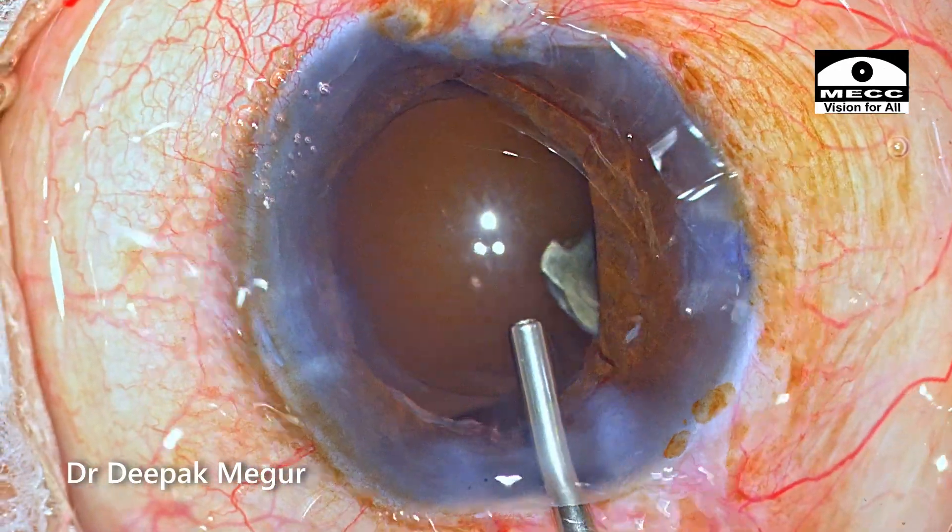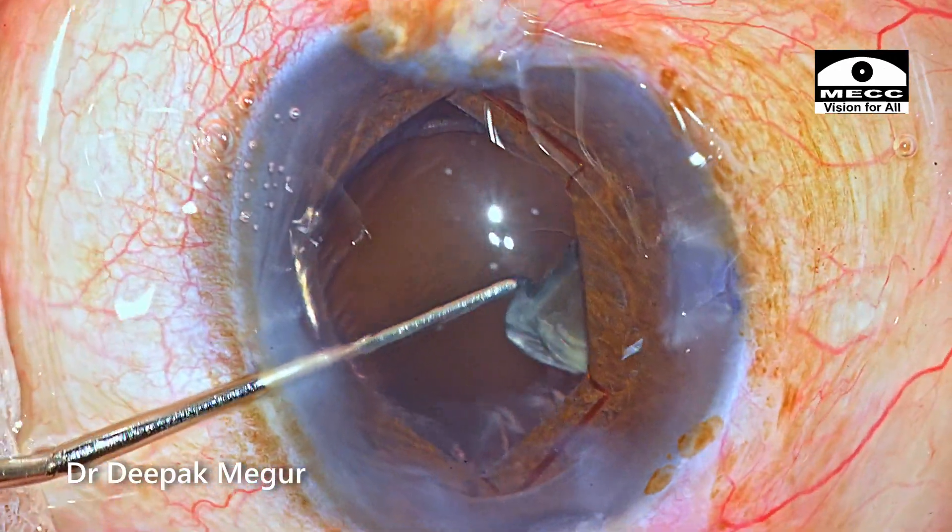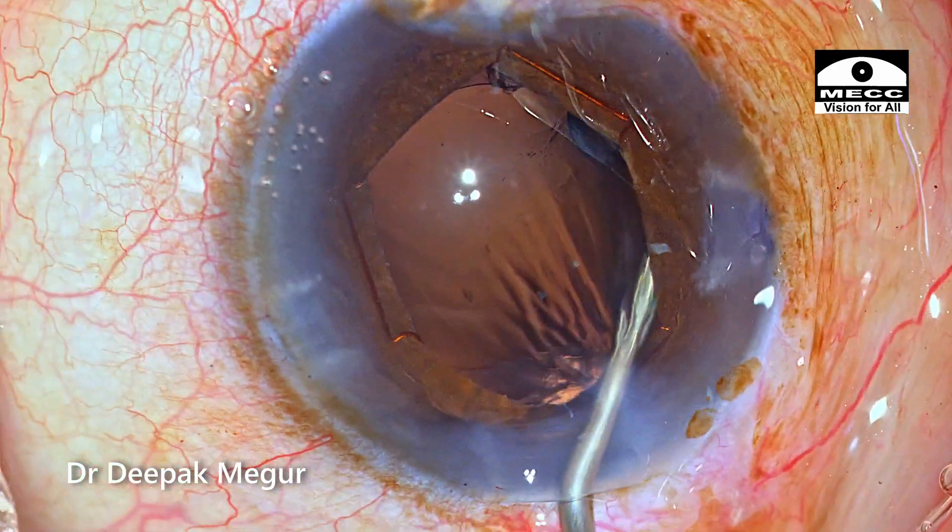The last fragment is hiding under the pupil. It's just manipulated out and eventually emulsified.